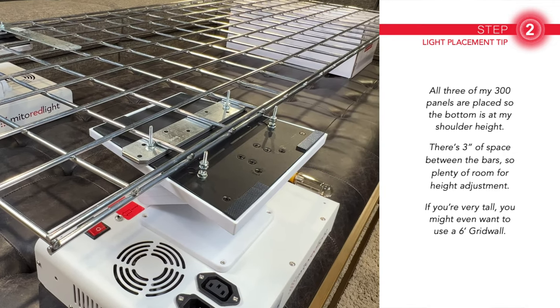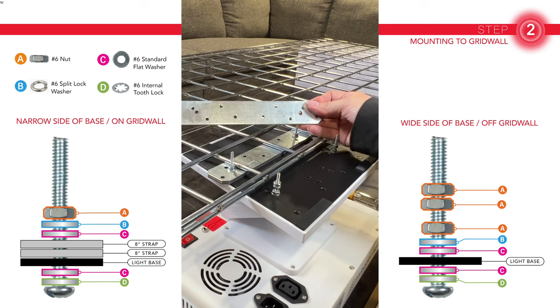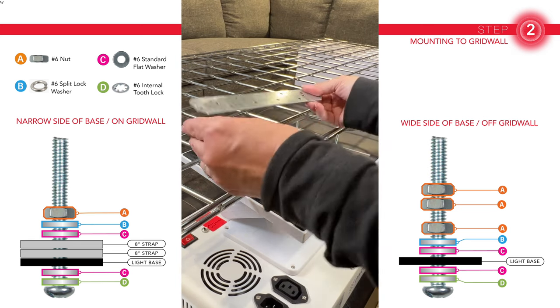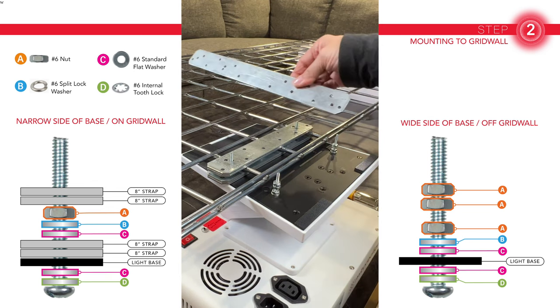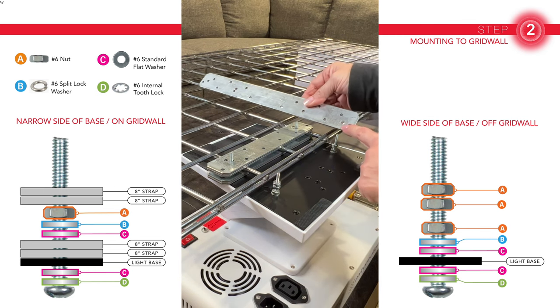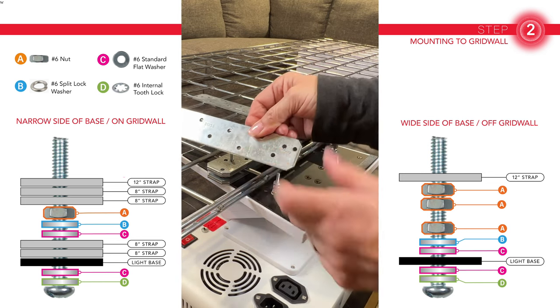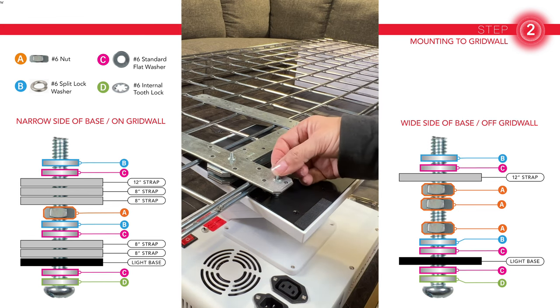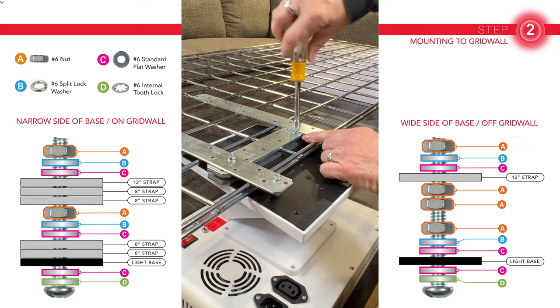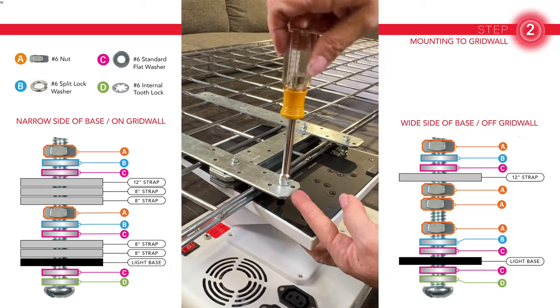As for where the lights are mounted: the wide end of the base needs to be off the grid wall. Center the edge of the grid wall between the two sets of screws — narrow side on the grid wall, wide side off. Here you'll use two more of those 8-inch straps with holes drilled 5¾ inches apart, as well as 12-inch 12-gauge steel straps, though I think the 8-inch straps would have worked fine here too. On these, drill two holes 2½ inches apart so they line up with the wide side screws that are off the grid. On each screw, put a flat washer, a split washer, and lastly a nut. The nuts on the narrow side need to be tightened really snug, but the ones off the grid wall, just lightly tighten those for now.